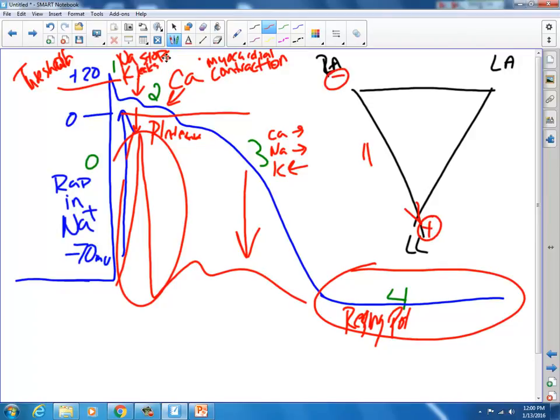Now, I'm going to throw a positive up here. What is this axis here? And then, so now I'm throwing a negative here and a positive here. What is this axis? Lead 3. And again, it's just all views of the heart. Okay? All right.